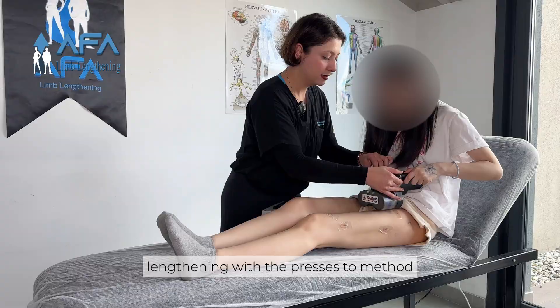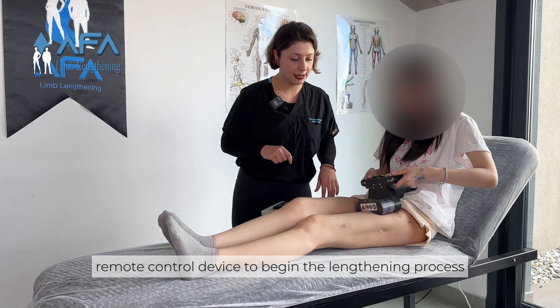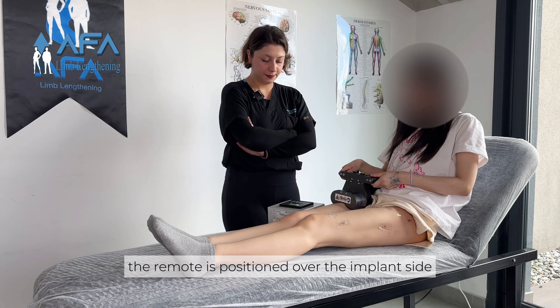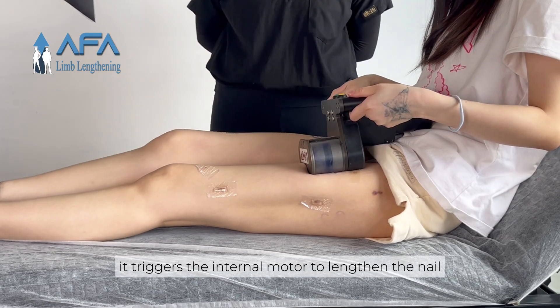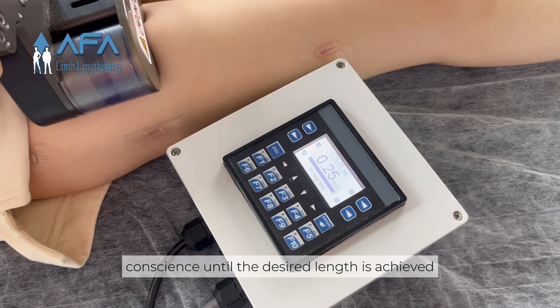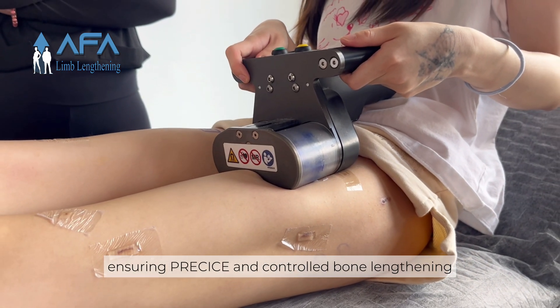Lengthening with the PRECISE2 method involves a few key steps. Patients use the external remote control device to begin the lengthening process. The remote is positioned over the implant site, and with a simple activation, it triggers the internal motor to lengthen the nail. Gradually, this daily adjustment continues until the desired length is achieved, ensuring precise and controlled bone lengthening.